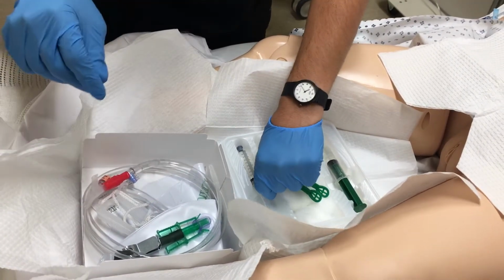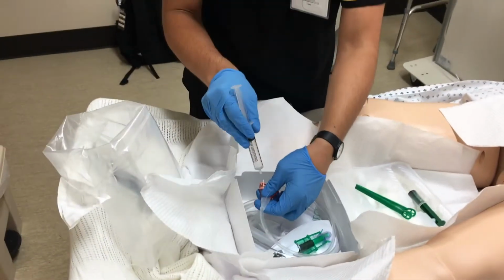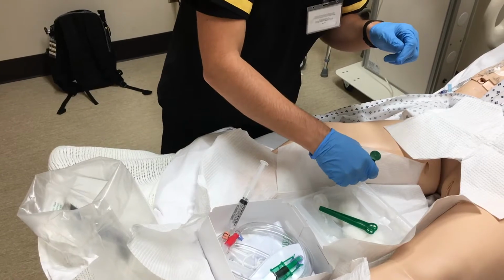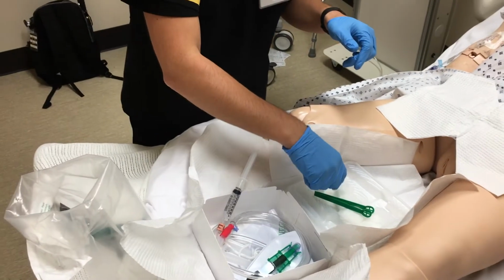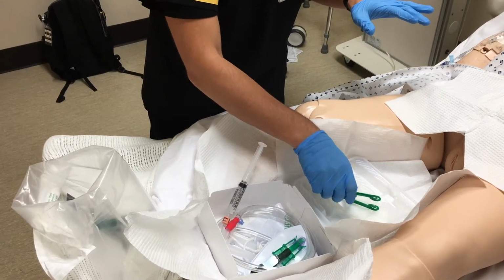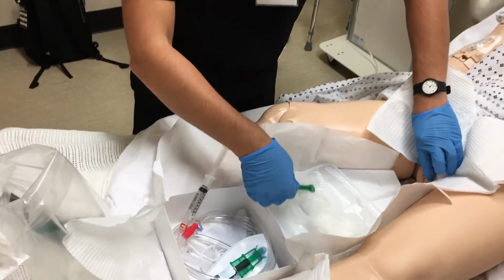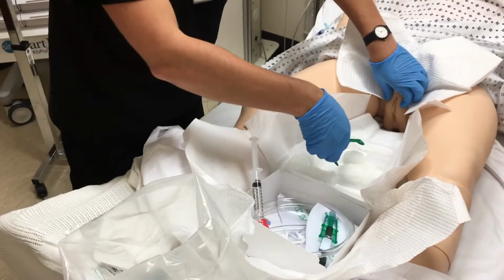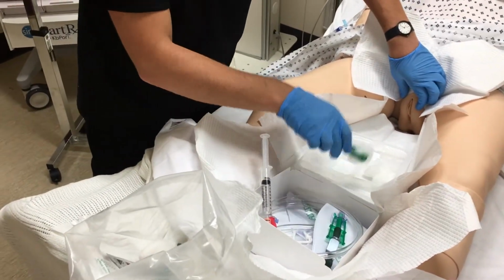Let me go ahead and get this water connected. I'm just going to put some lube in this tray. Now, I think we're ready. I'm just going to hold my pressure right here, and we'll sterilize down here with the betadine. One more.